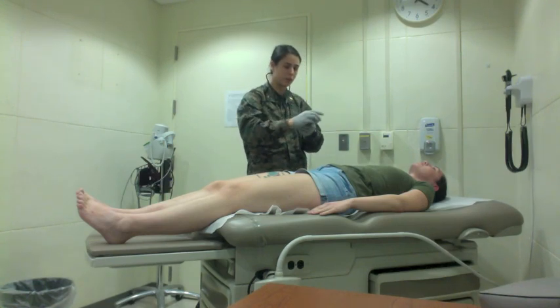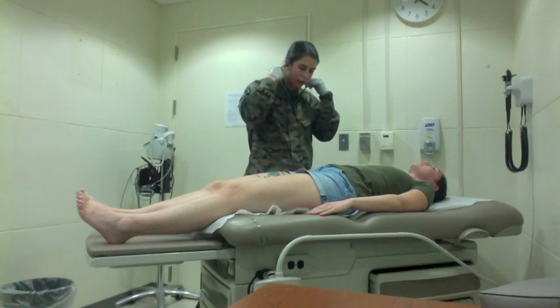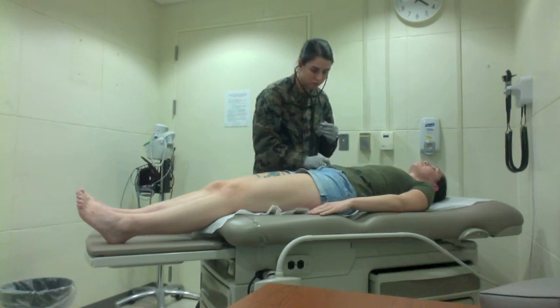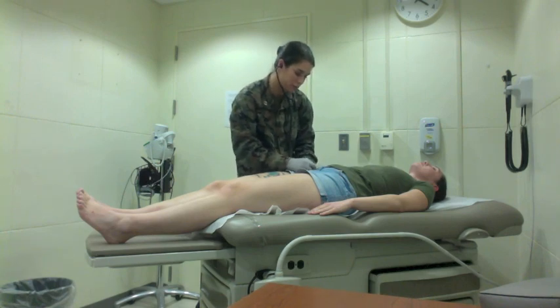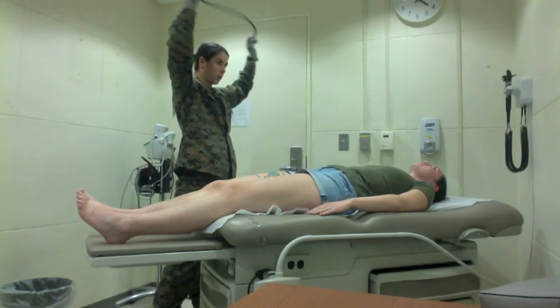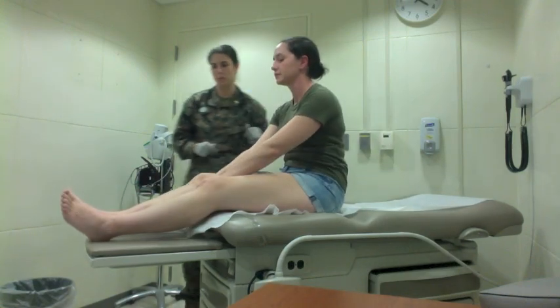And then I'm going to listen for bruits over the abdominal aorta, iliac arteries, and femoral arteries. Okay, and then I am going to have you sit up. We are going to move on to muscular.